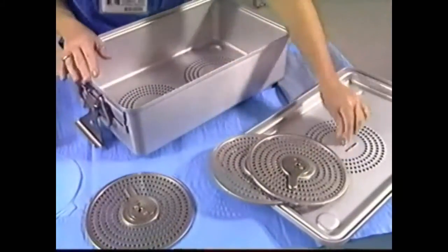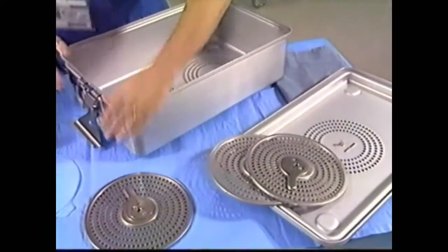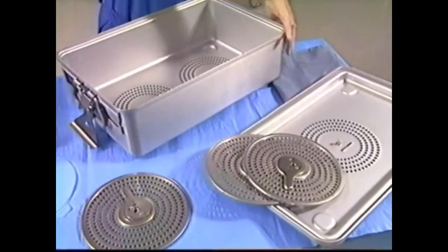Verify that the filter retention post or posts in the lid and label holders on the front of the SteriTite container are secure.